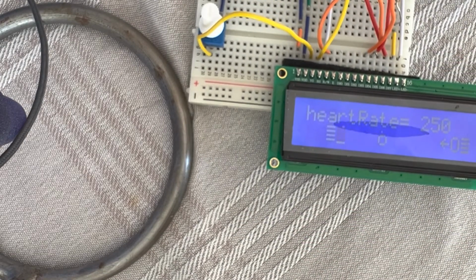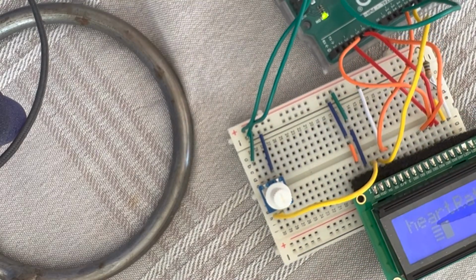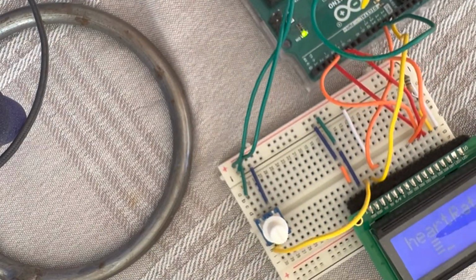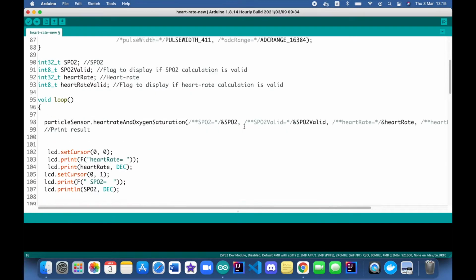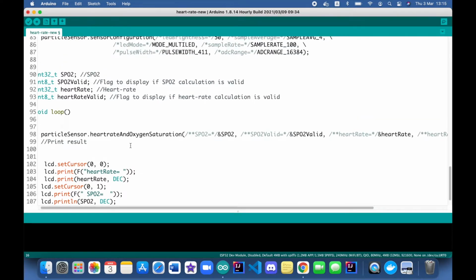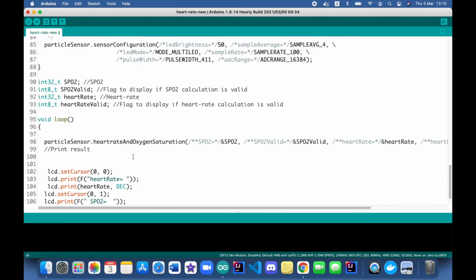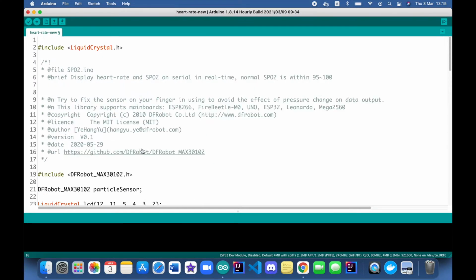Yeah, at the end of the video I will show the serial monitor as well, but for this one it will be just on LCD. So this is the example with SpO2, which is oxygen saturation, and also the heartbeat, the heart rate. The code is on their GitHub account. We can download it, and I'm going to show you how.